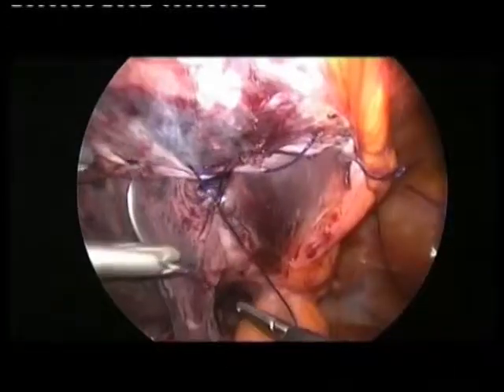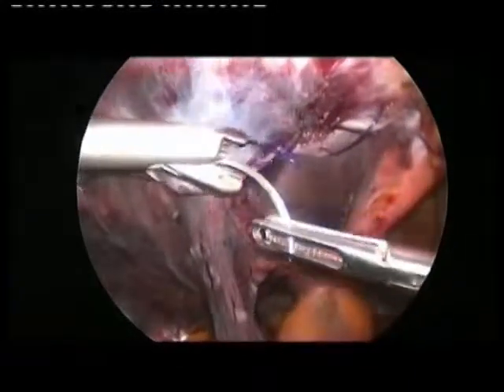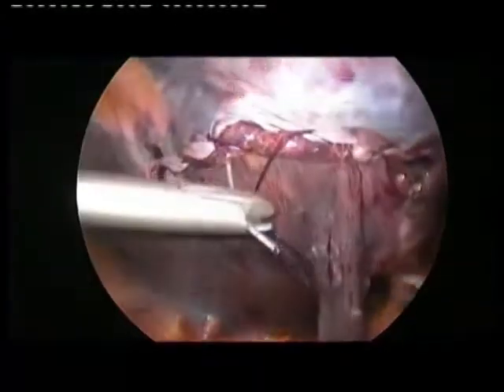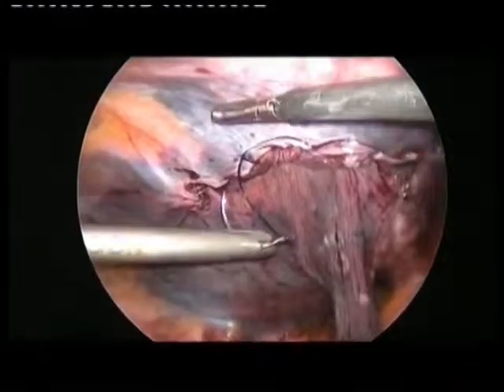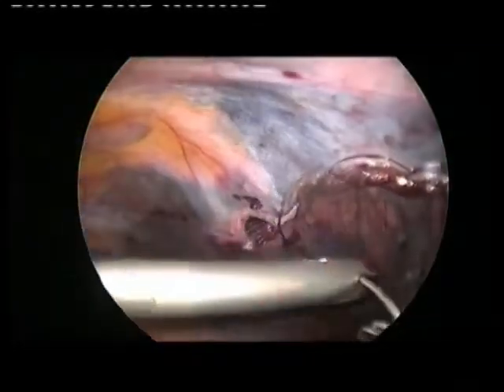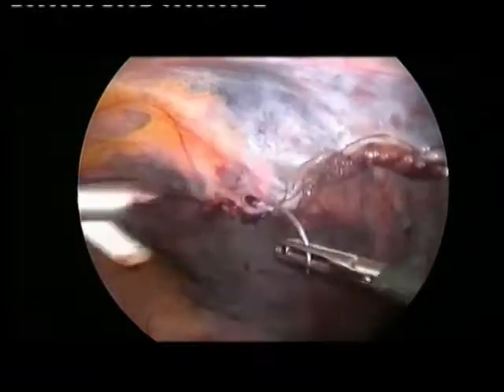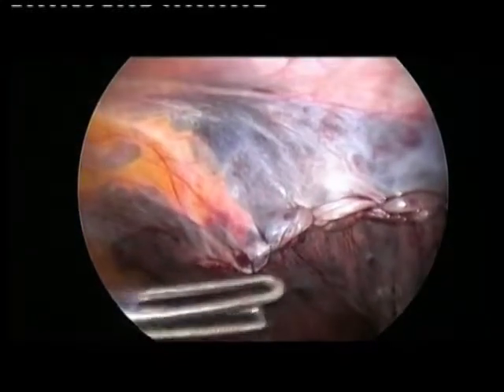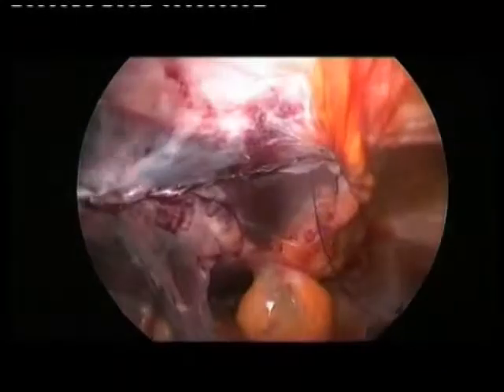Stitches to close. Yes. And now we suture. Inflate to 5 as well. Ok, we inflate the balloon. If we can have the laparoscopic image, it's very important to put the first stitches on this side.